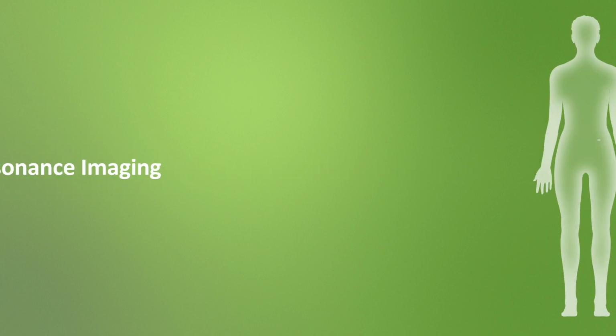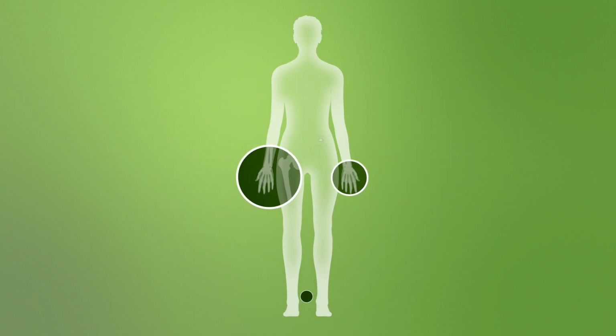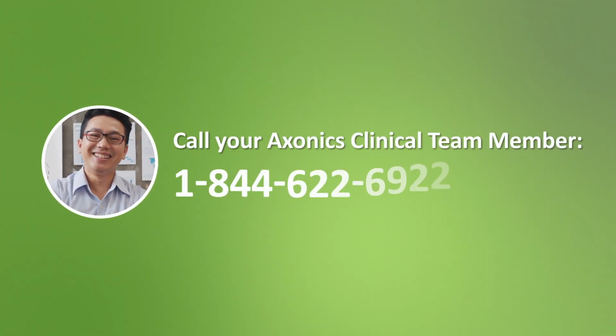With the Axonics system, you can get typical MRI scans, including head scans, whole body scans, and extremity scans. Your physician orders the type of MRI you need, and the MRI center will know how to conduct your scan. If you've been scheduled to get an MRI, you should let your MRI center know that you have an Axonics implant. You can also call your Axonics clinical team member directly at 1-844-622-6922 if you have any questions.